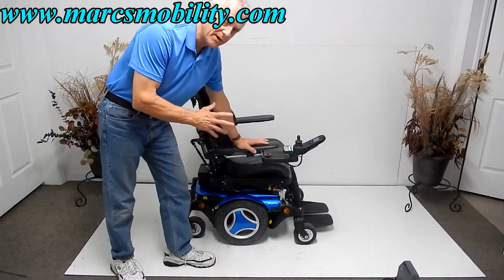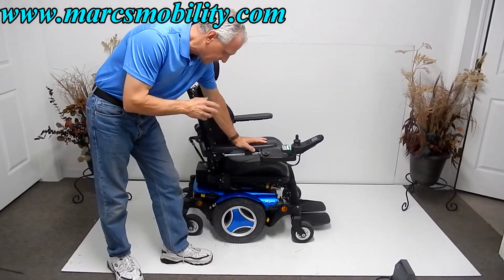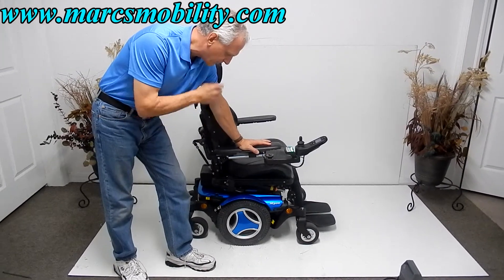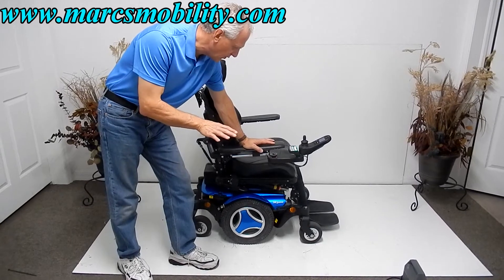This is a Permobil M300 Power Wheelchair. This is a used power wheelchair — it was used for about a year and a half or two years. Excellent condition. It is fully loaded.